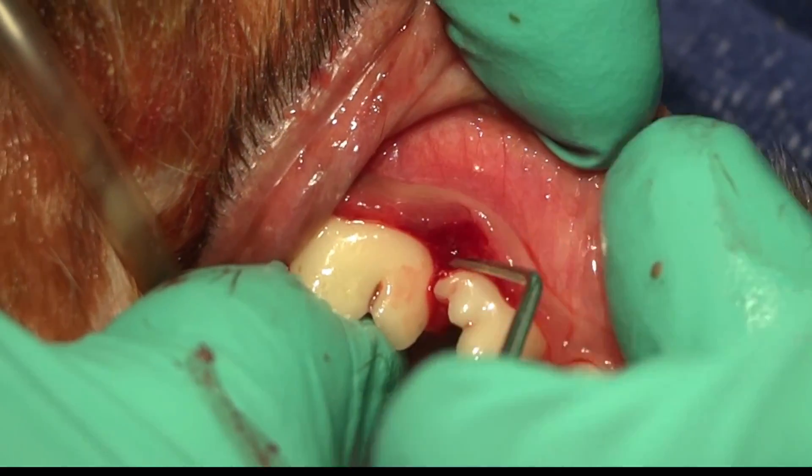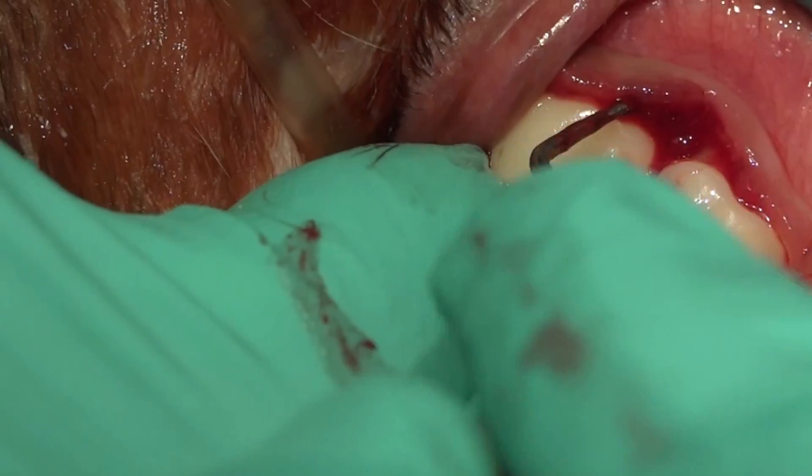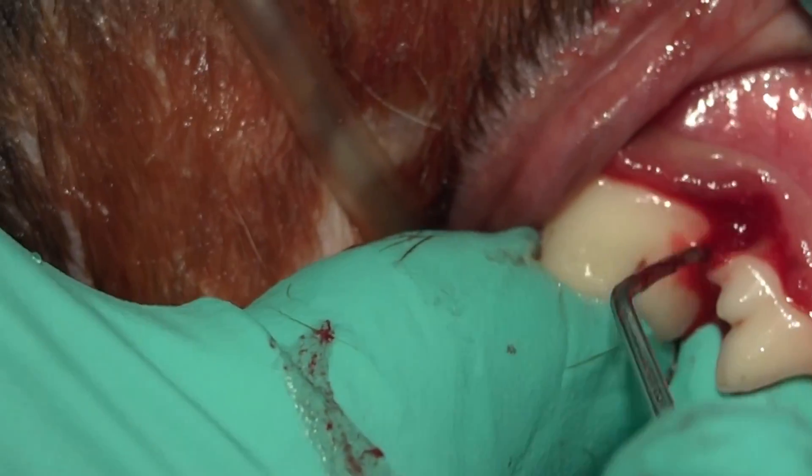What we're going to do is use our periodontal curette to eliminate the granulation tissue and expose the root surfaces, making sure that everything's nice and clean.